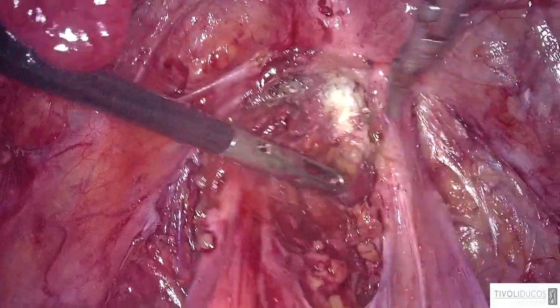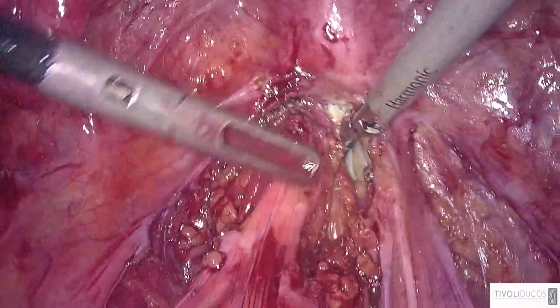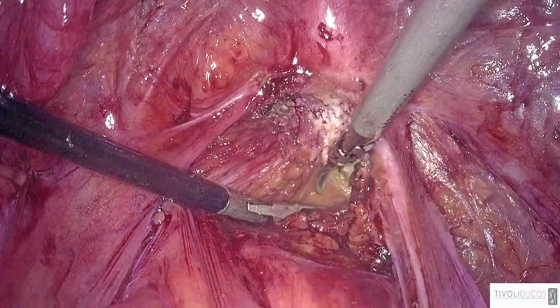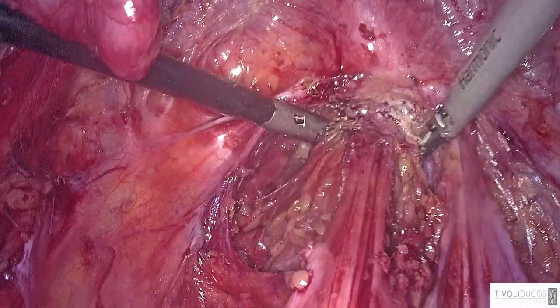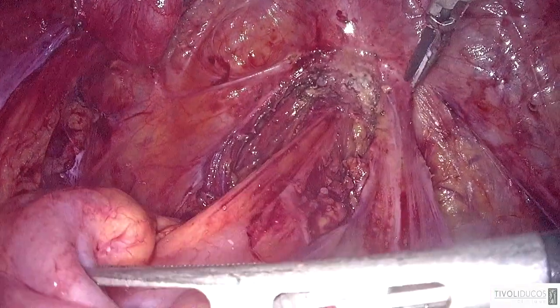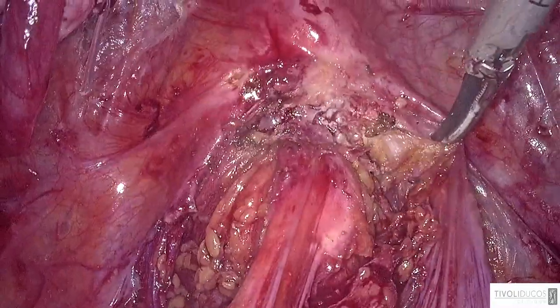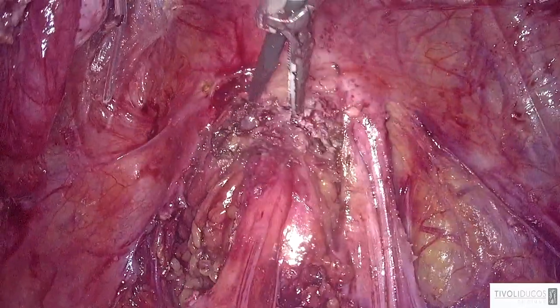And actually, I think in our department we have a pretty low rate of bladder dysfunction, meaning any post-voiding bladder volume superior to 100 milliliters, because we take care to preserve the nerves. The nerves, splanchnic nerves, are located below the ureter. So, by keeping the dissection close to the rectum we completely avoid injuring them, and then once the rectum is released, we can attack the parametrium and dissect progressively.